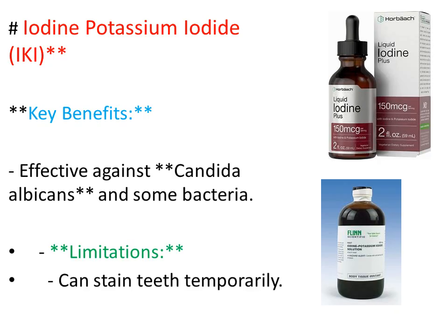The staining is mostly temporary and disappears after a couple of days, but it has good benefits against fungi as well as bacteria in the canal.